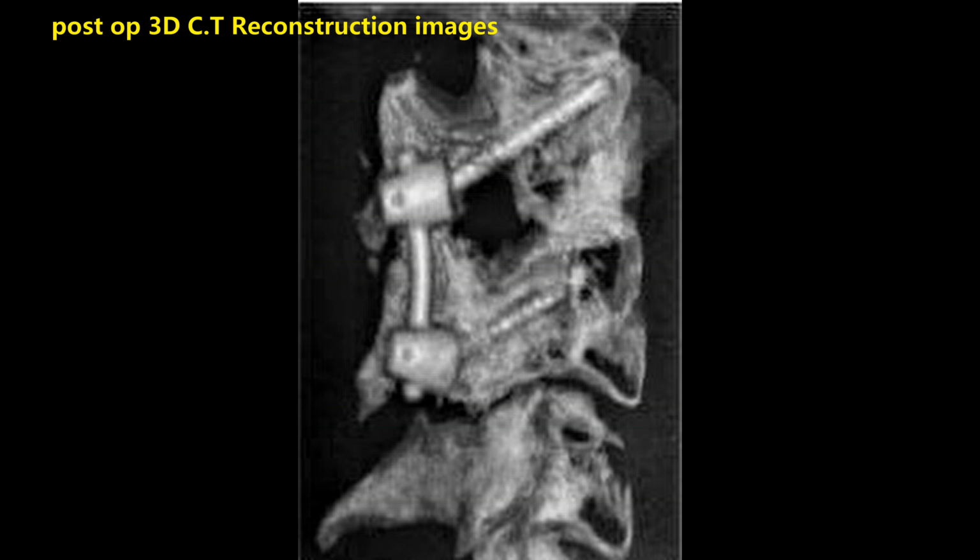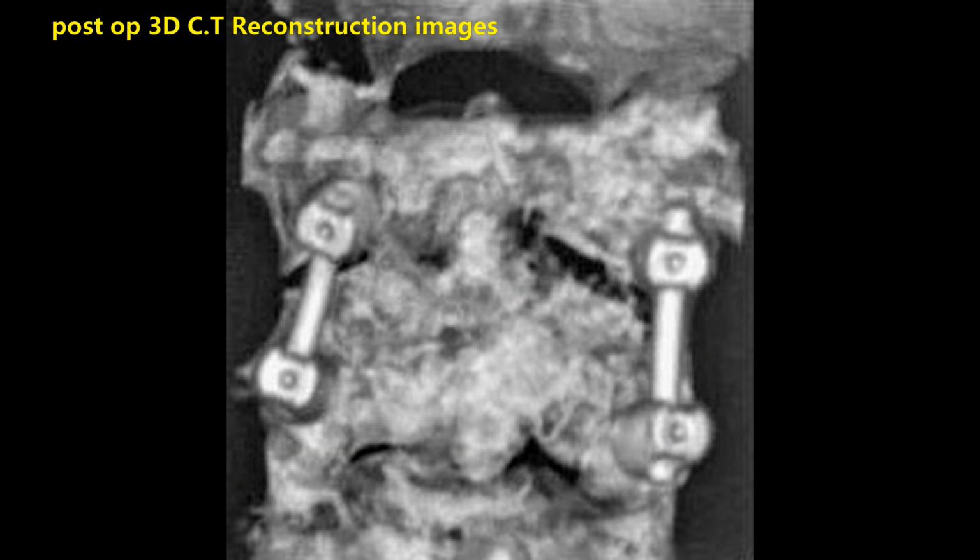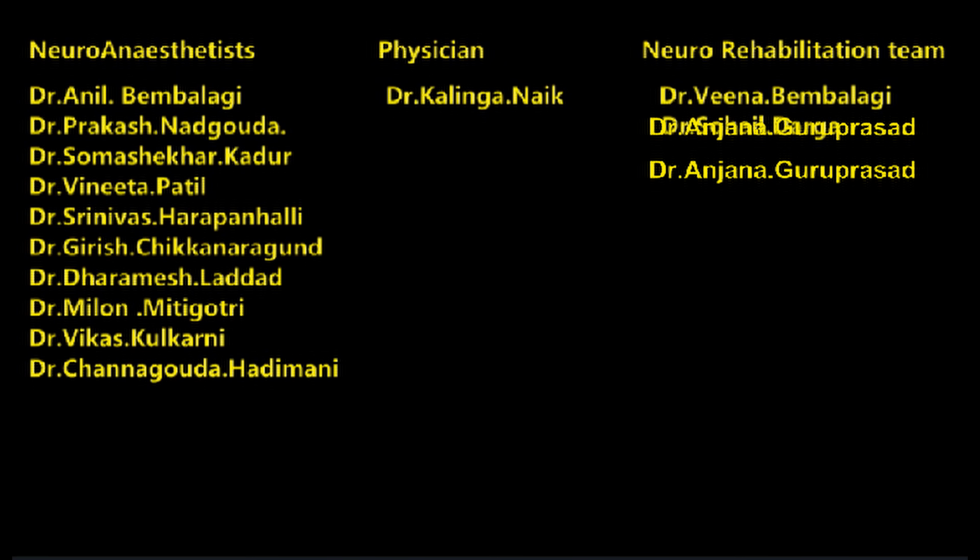These are the 3D CT reconstructions of the screw placements on both the sides, right side, left side, and in the center. This is our neuroanesthesia team, treating physician, neuro rehab team.